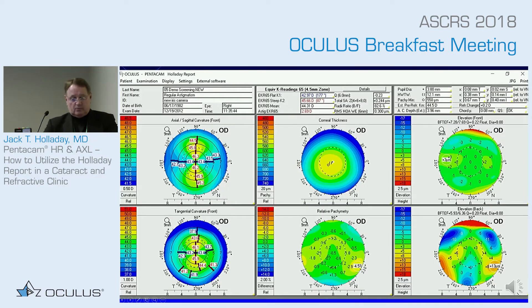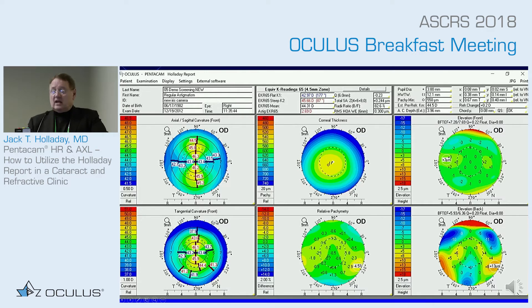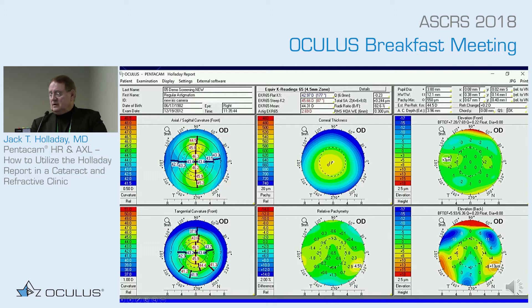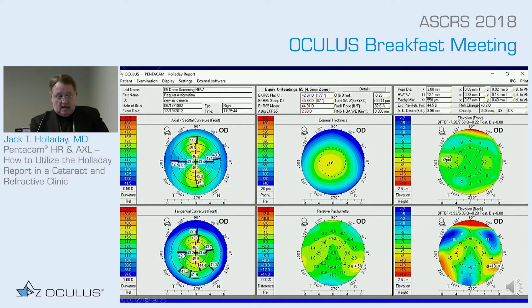Here is a typical example of a patient with regular astigmatism. The map is set up so the upper left panel has demographic data, the upper middle panel has quantitative data, and the upper right has additional values. There are three columns: the first has topography information, the second has pachymetry information, and the third has elevation information.